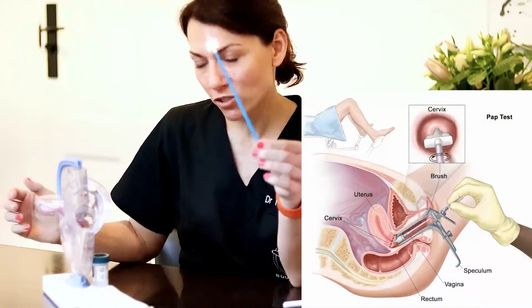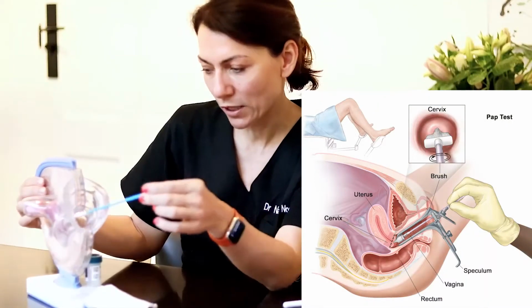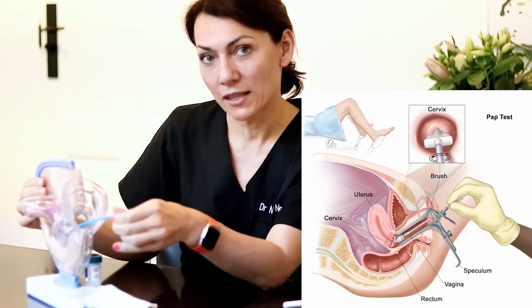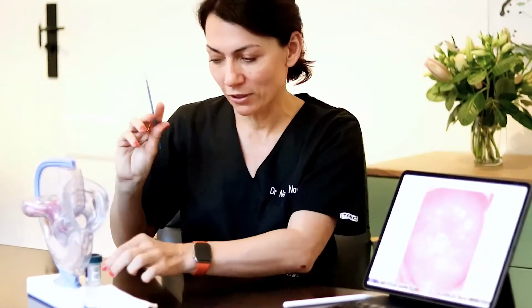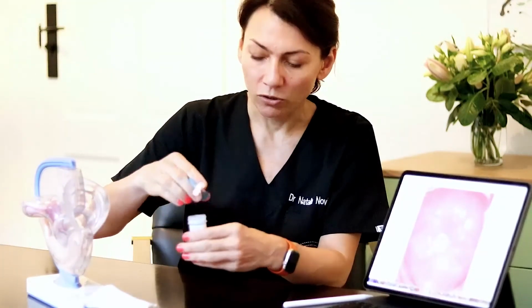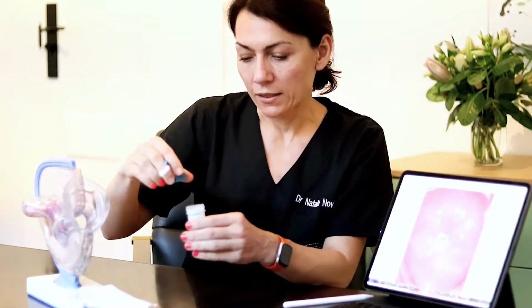is a procedure that is performed to assess abnormal cells on a pap smear. When we perform pap smears, we use this brush that is put into the vagina via speculum, and we rotate it a few times in the cervical canal and get abnormal cells or normal cells, whatever cells are there, put them into this bottle. It's called liquid-based cytology or LBC. And this sample goes to the lab.